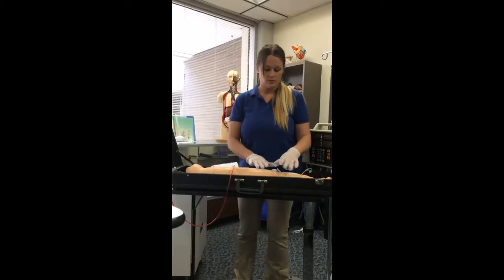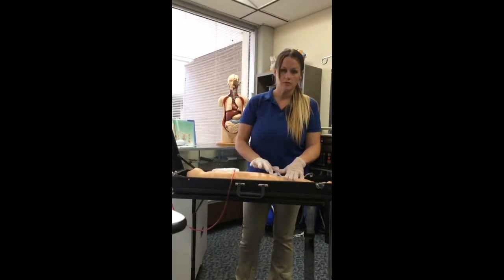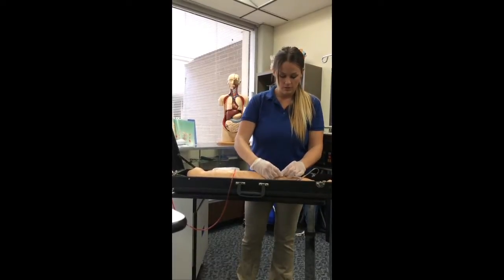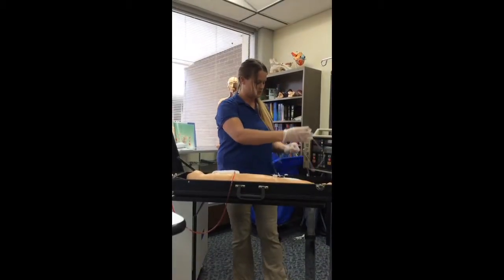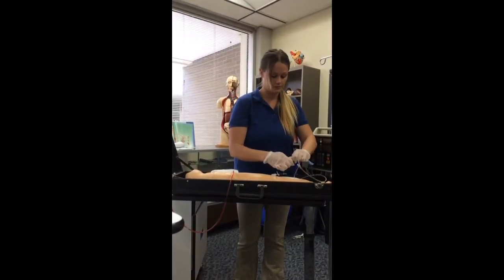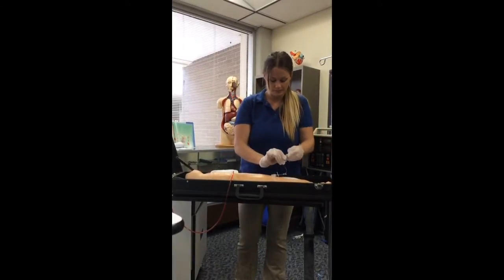I'm going to inspect the site, ask the patient if he has any side effects, make sure there's no redness or swelling or infiltration. Then I'm going to clamp this, turn the medication off, unhook, wipe this with alcohol.